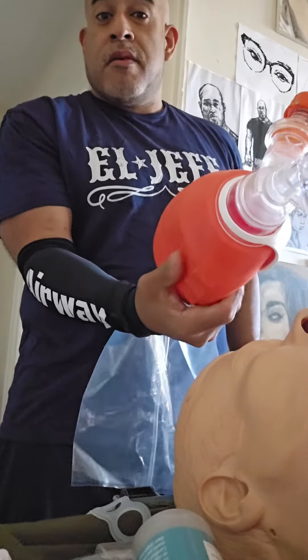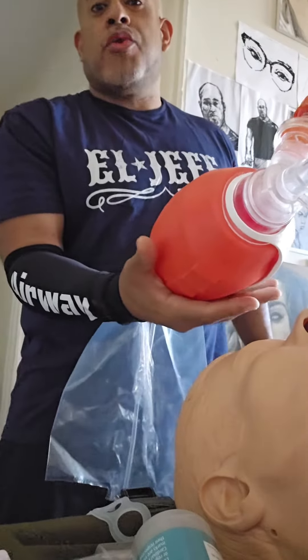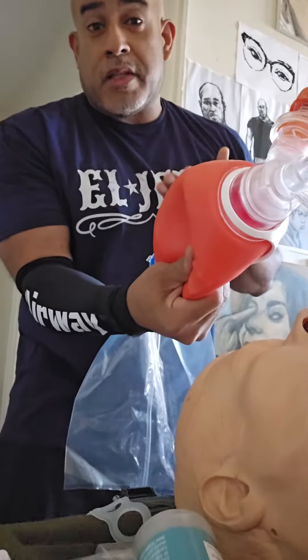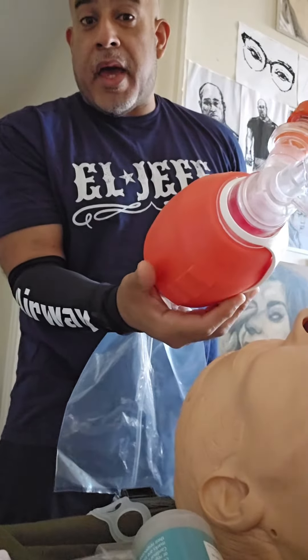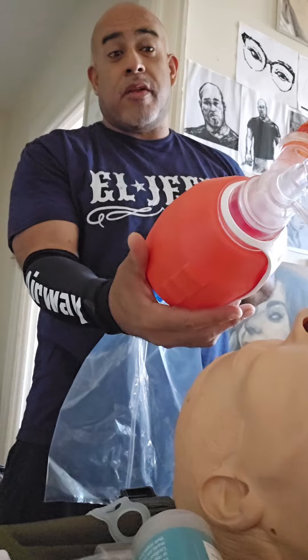You have to bag underneath, like cradling a football — not the correct way of holding a football during a game, but like cradling a nice, generous loaf of bread, the most expensive piece of bread you're about to give to someone. Bag it, let it expand. Let it expand. Some bags are very special — I can talk about that a little later.